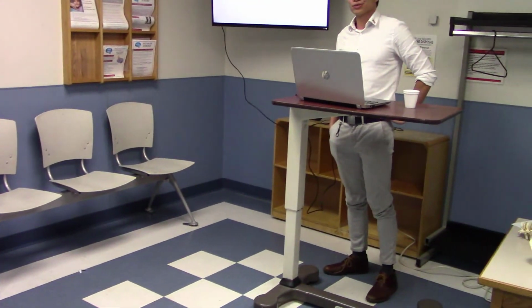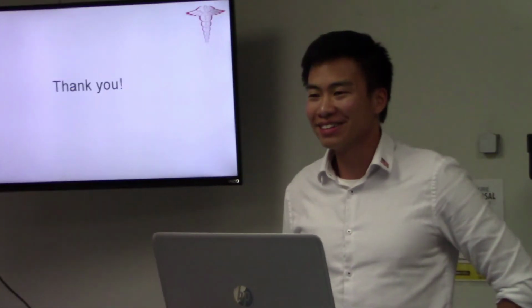So although not perfect, although I still would say that the sitting versus standing X-ray, of course, would be more the gold standard for radiologic diagnosis of hypermobility, dynamic instability. If there's a low-cost, more user-friendly approach, that's a plus. So very neat. It'll be interesting to see how it turns out. And I feel like if the radiologists start to trust the research more, then they'll be more open to dynamic X-ray eventually.